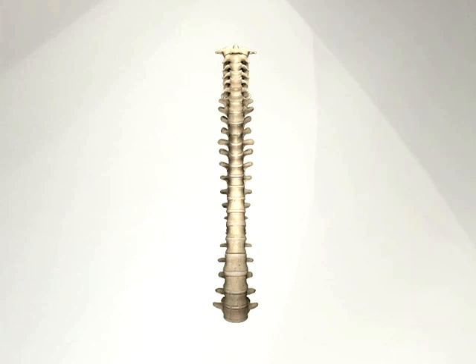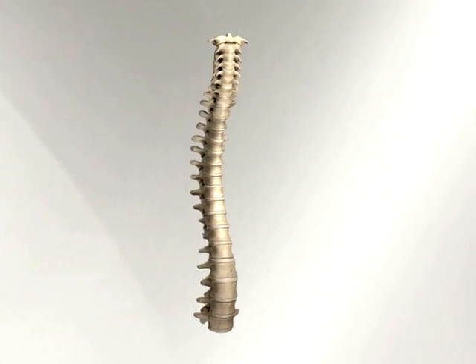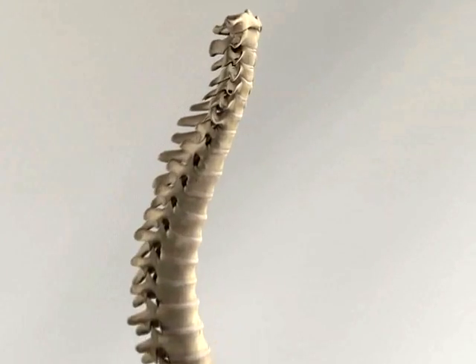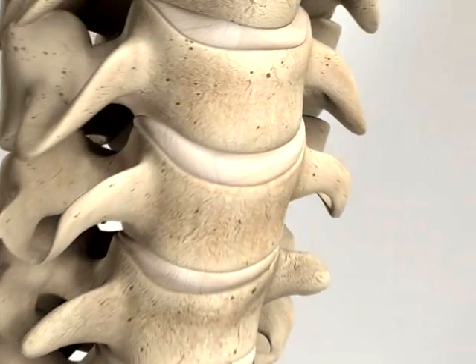The surgical technique is the same as for a standard anterior cervical discectomy and fusion with or without plating. The patient is placed in a supine position with the head resting on a doughnut or in traction. Removal of all disc material back to the posterior annulus is taken care of, and a block bone graft is inserted into the intervertebral space.